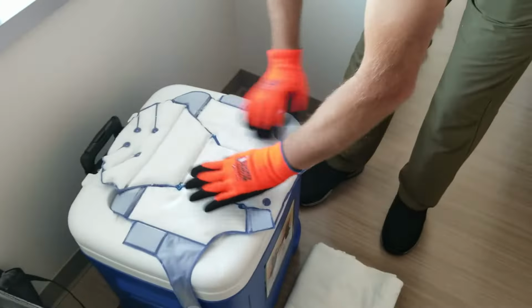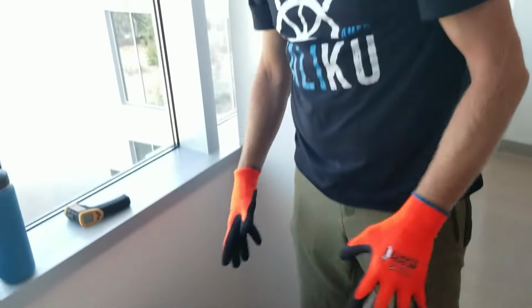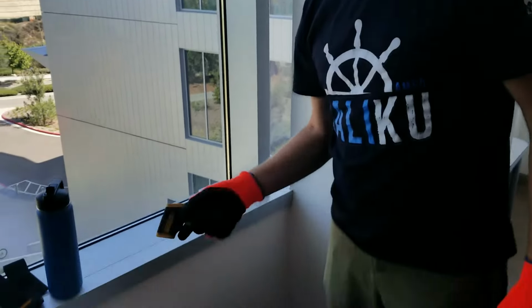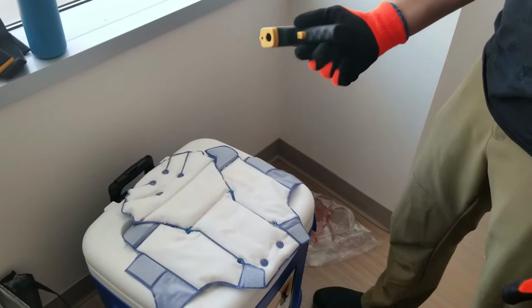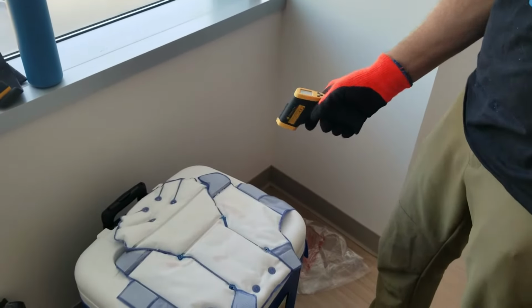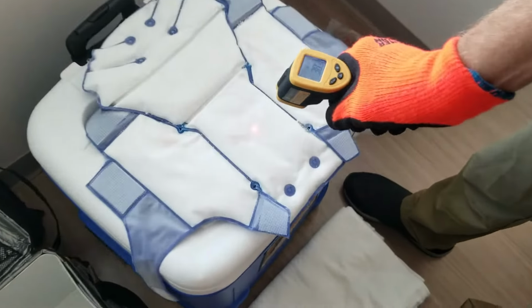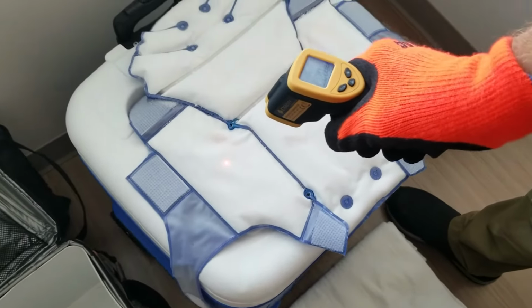Some tips and tricks: you probably want to have a pad down here for your knees. Have an extra towel around, which I don't have today. Grab your thermometer, it usually comes with the kit. I think this one's a 9-volt battery, so make sure you have extra batteries. You check the temperature. Right now that's negative 37, 38 degrees Celsius. Check over here, 21, 22.